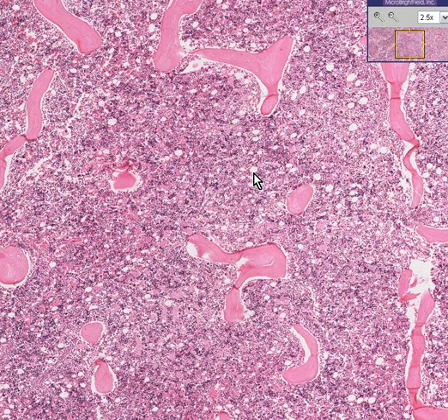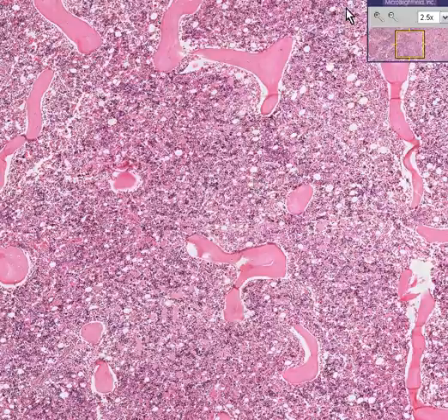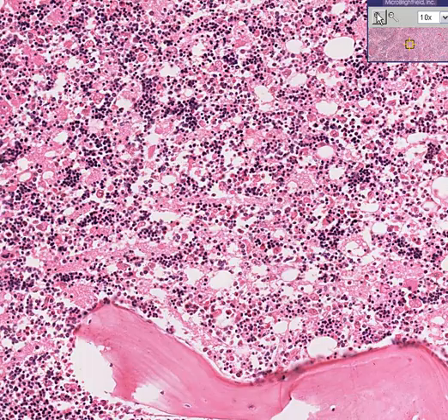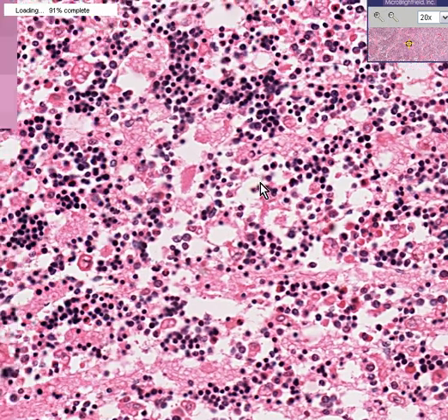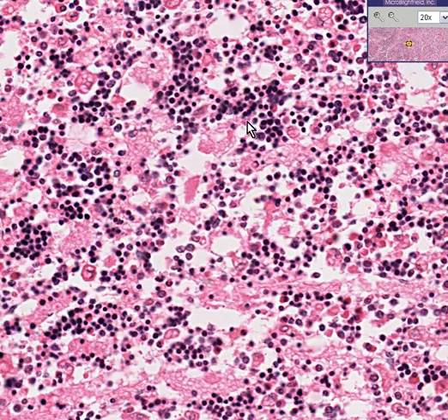So first of all, we have an increased cellularity. The other thing that we're going to see, and not as nicely as we'd like to because this is a tissue section rather than a smear, is that whenever you see little groups of cells like here, these are all erythroid cells. Here, here, here, here, here.